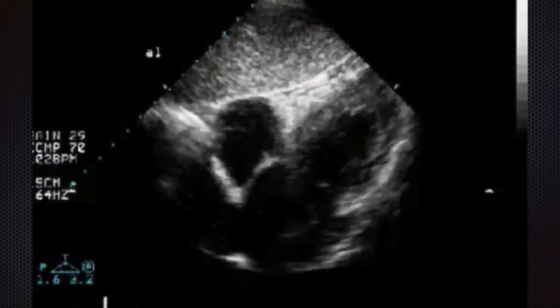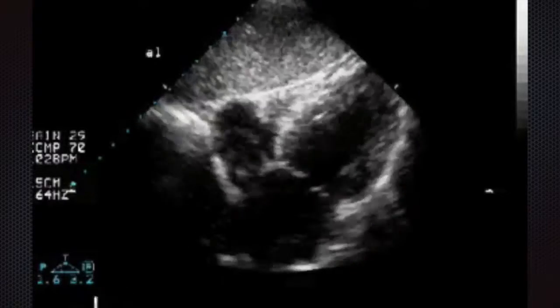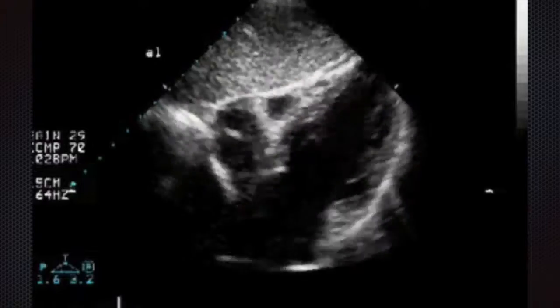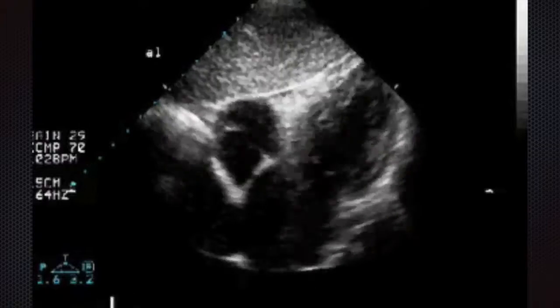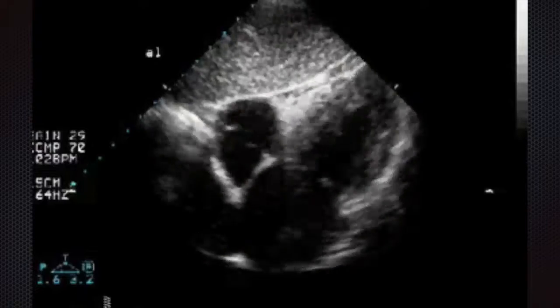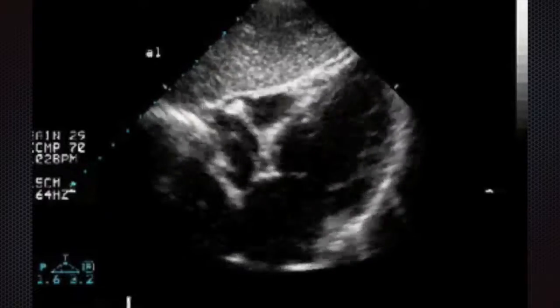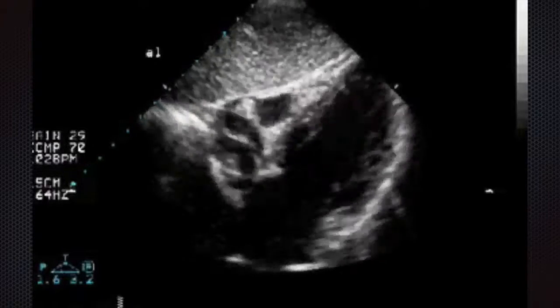The other thing to notice is that the left ventricle has much thicker walls to contract, and you can see the mitral valve at the base of the left ventricle, and below that the left atrium, and across the septal wall is the right atrium. Now the ratio on this view is that the right side of the heart shouldn't be more than 2/3 the width of the left side of the heart. So if you were to look at where the mitral valve is on the annular plane there, it certainly is wider in the left side than it is on the right side.